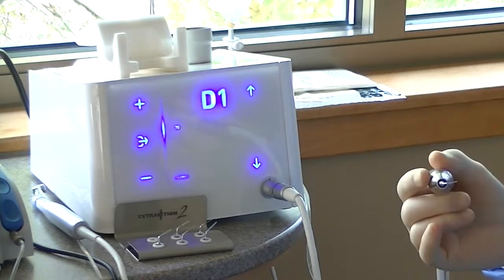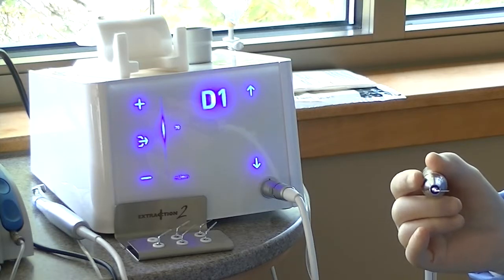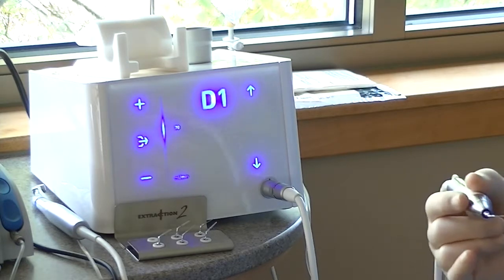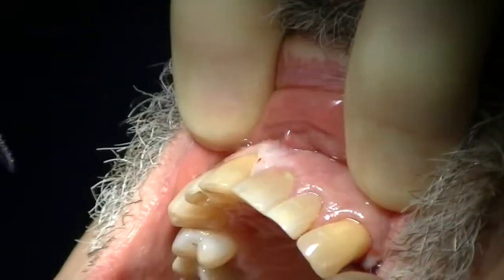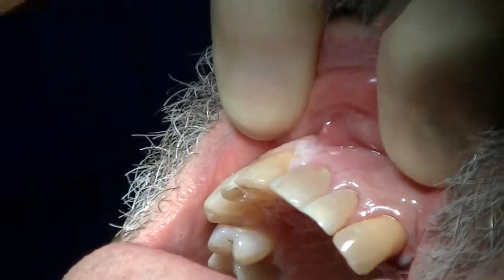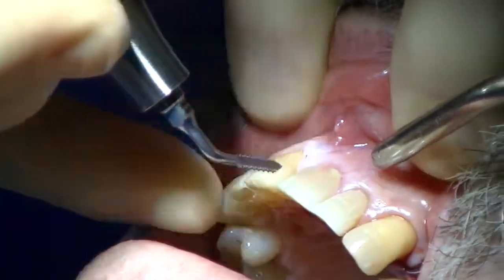You saw the external resorption of the tooth, so the coronal portion or the crown portion could potentially crack off, but let's see how we do using the piezo. Once we do that, we can evaluate the socket site. So we're taking out tooth number 9. You can actually see the defect, and what the piezo does is it creates vibration, and will eliminate the PDL without damaging the facial plate of bone. That's what we're hoping for here.